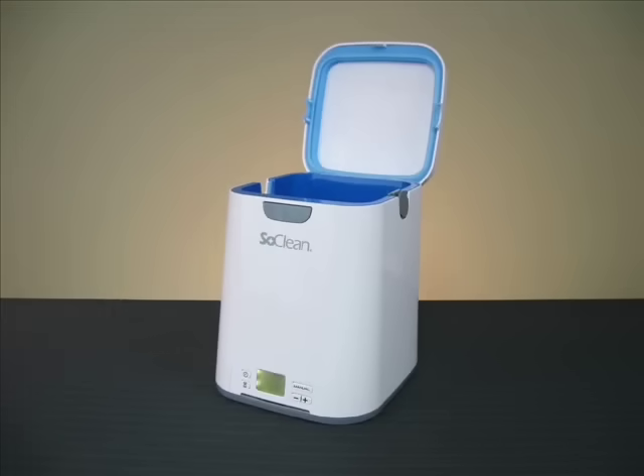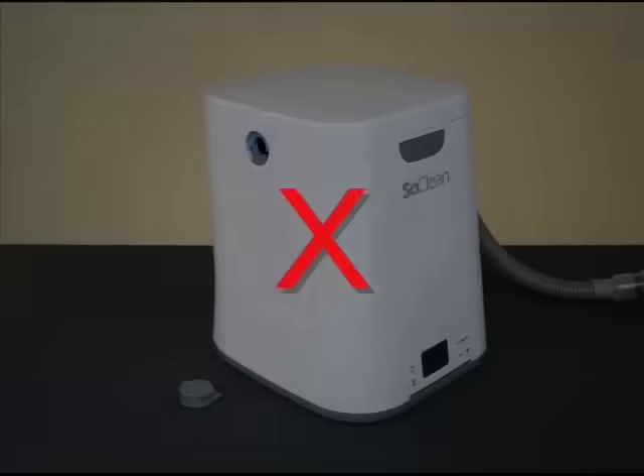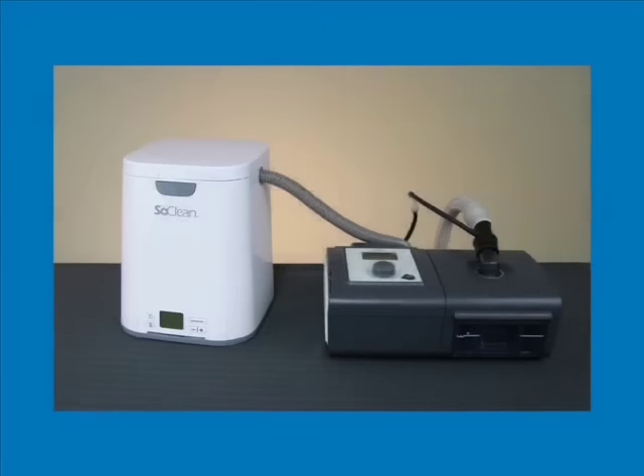Please note: the SoClean will never operate without the mask and hose present in the securely closed chamber. Neither will it operate if the hose slot plug is missing or improperly positioned. When sanitizing, even though the actual run time may only be 5 to 10 minutes, it's important to let the mask remain in the closed chamber for an additional 2 hours.